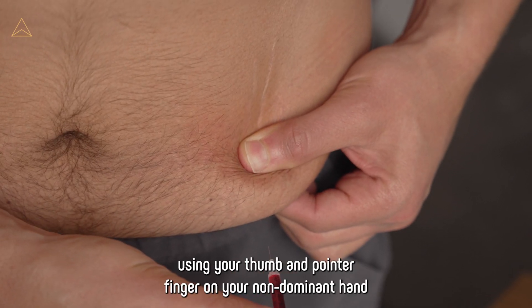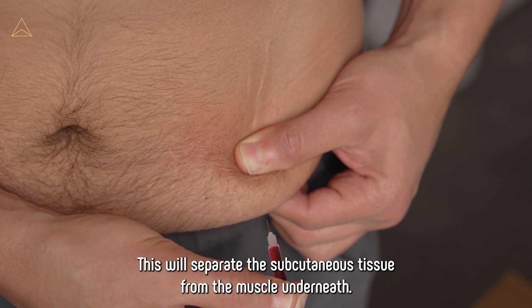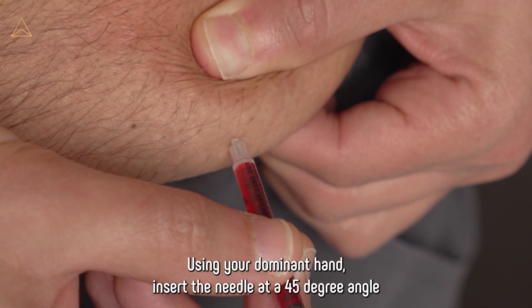Pinch the area using your thumb and pointer finger on your non-dominant hand. While pinching the area, lift it away from the body. This will separate the subcutaneous tissue from the muscle underneath. Using your dominant hand, insert the needle at a 45-degree angle.